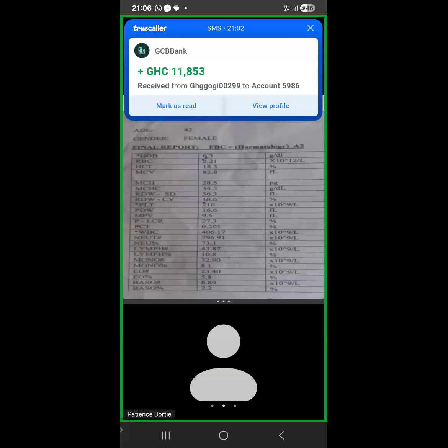If you look at the RBCs, for example, what would be your expectation? So for the RBCs, I'm expecting to see some retics there because the MCV is normal. So there will be some normal RBCs there, but there will be some retics there as well.